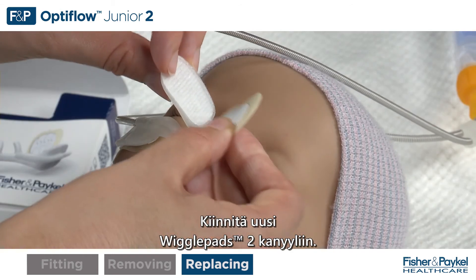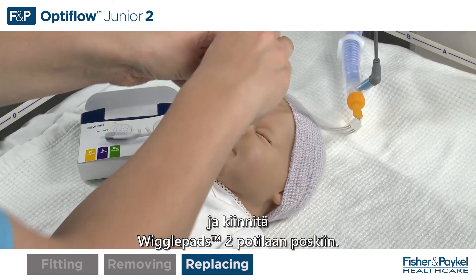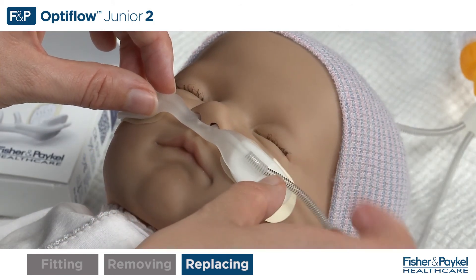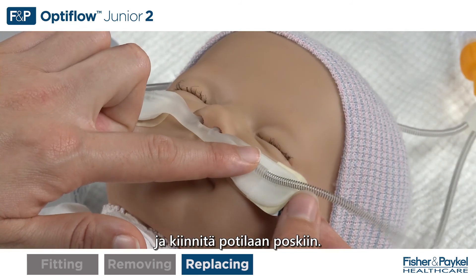Adhere the replacement wiggle pads to the cannula. Remove the first backing tabs and stick the wiggle pads onto the patient's cheeks. Remove the second backing tabs and stick onto the patient's cheeks.